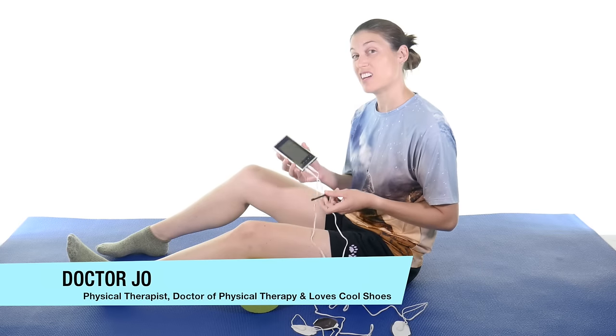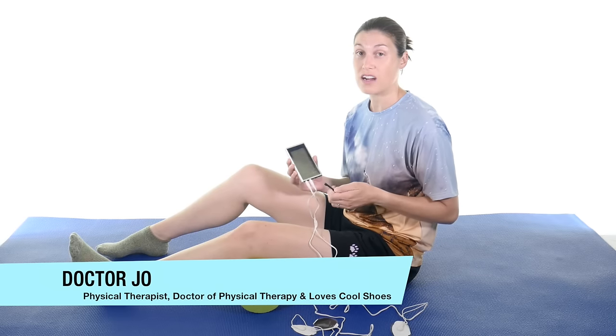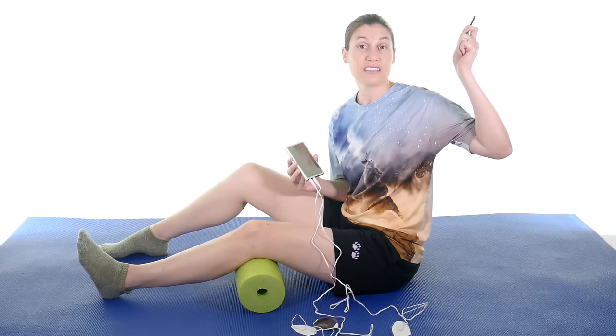So the folks at HealthMate Forever sent me their T12AB TENS EMS unit. They have a whole bunch of different units — wire, wireless — so make sure and check them out by clicking the link up there.